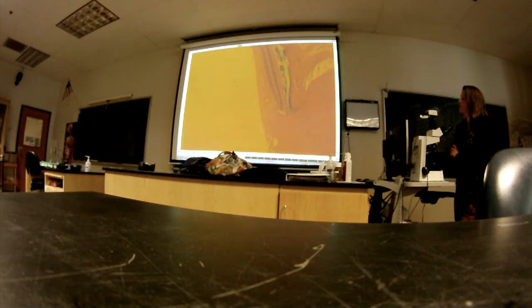And then we move into this area. We're at the posterior part of the eye, so I might give you a hint as to that. Anterior is over here at this end. You see how the organization totally changes and disappears right here? See that? Okay, so then you can see the whole thing.